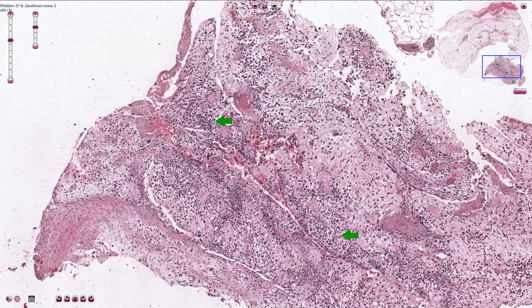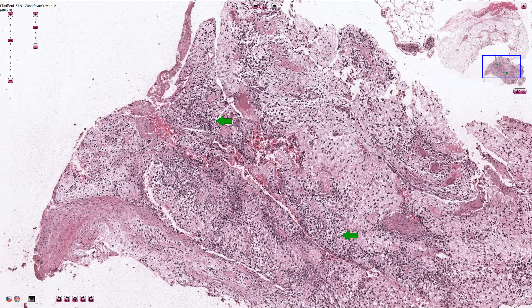Osteosarcoma is a high-grade malignant tumor characterized by osteoid or bone formation by the malignant cells. We recognize multiple different subtypes and types of osteosarcomas, and the most common is conventional osteosarcoma. It is the most common primary malignant tumor of bone, providing we don't count plasma cell myeloma and other hematological malignancies.